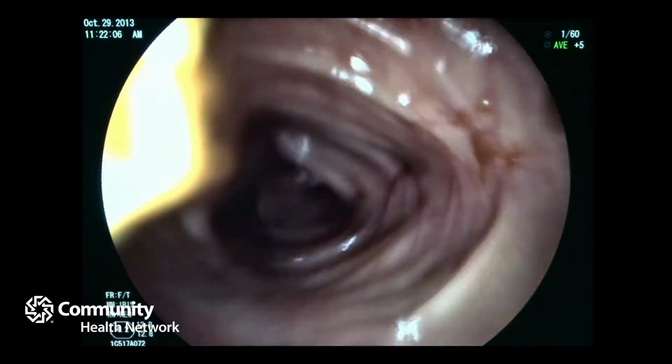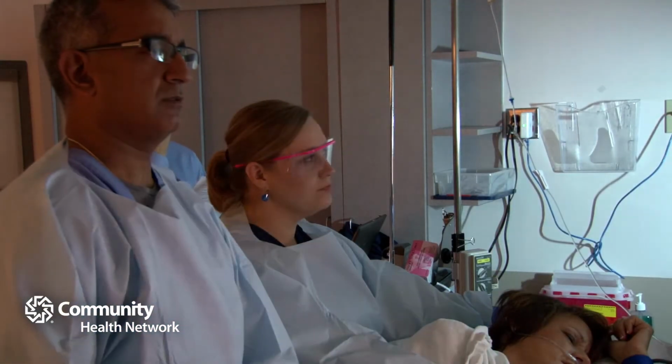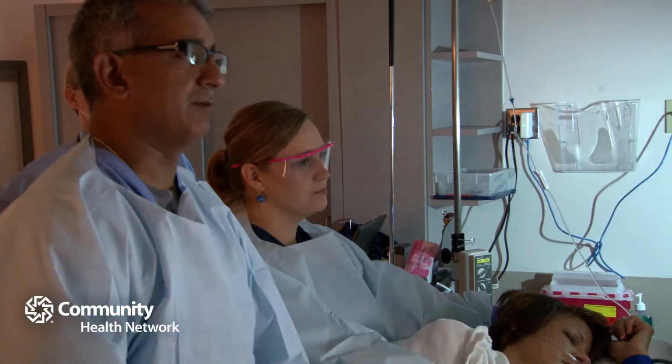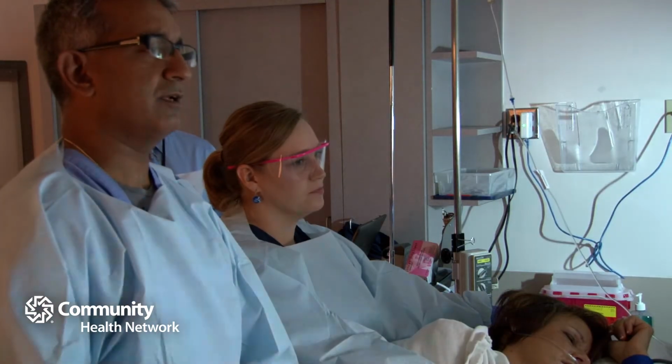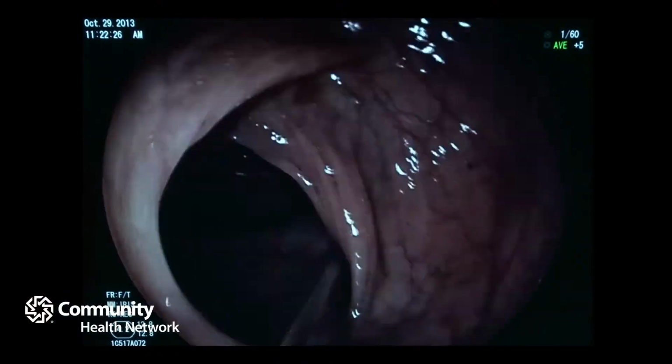This part of the prep, she did a really good job. And the key is on the withdrawal. Some people have a firm timeline that you're supposed to withdraw at least till. I just kind of go back and forth. You may hear people talk about 6 minutes. I think it's just making sure you do a good job.